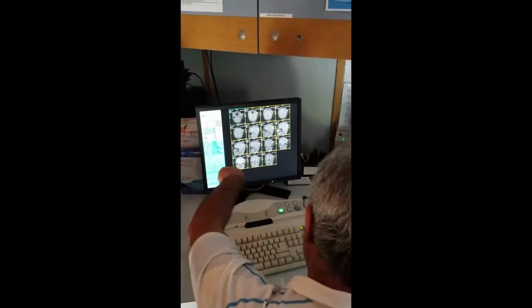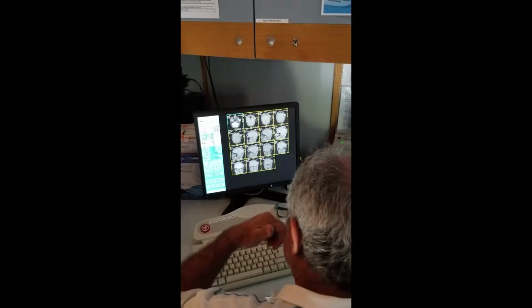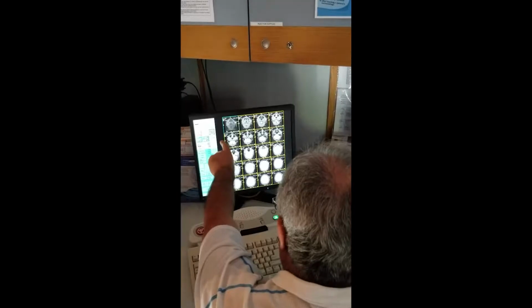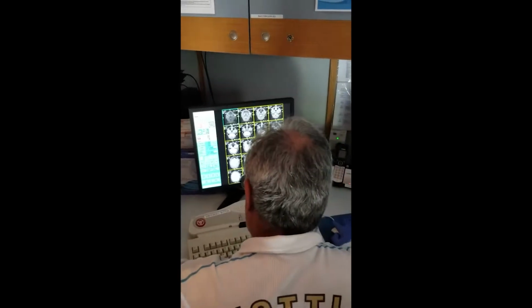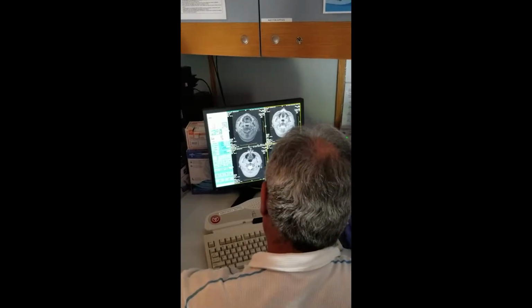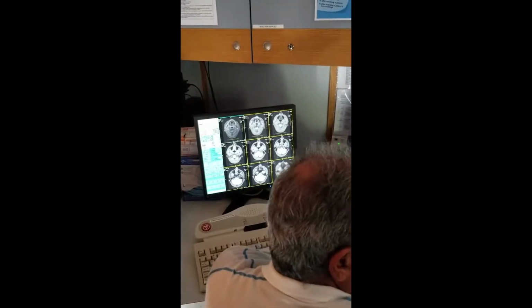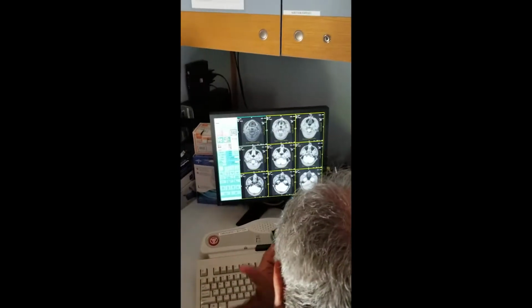As you can see, the smaller the image, the more information you lose. Where is my TR and TE and matrix? Can I see them? Because there is not enough room. If you want to see them, you have to go to maybe 4-on-1. See? There is room. How about if I go 9-on-1? How much do I lose? Oh, I lost them all. You understand what I'm saying or no? Yes. Alright. So most physicians like to see these 9-on-1 or 4-on-1.